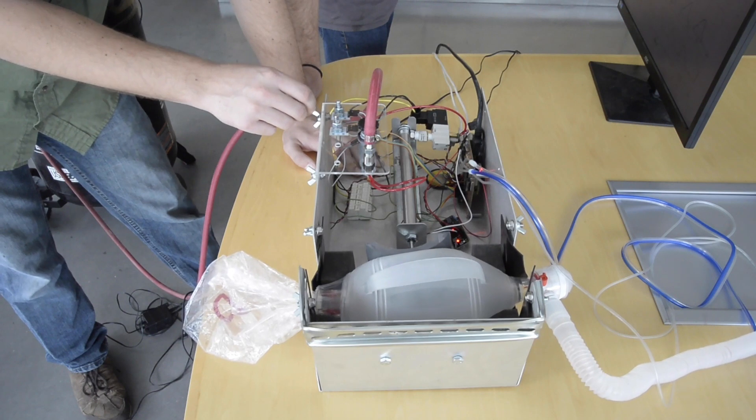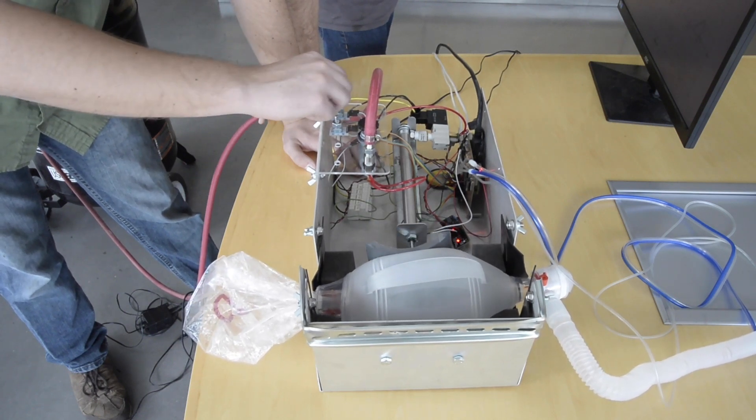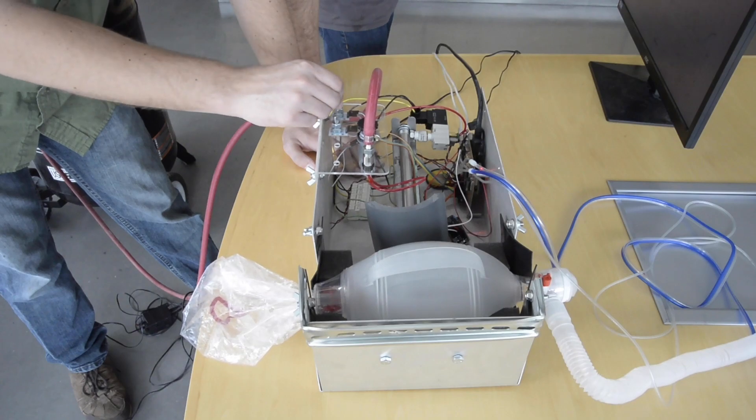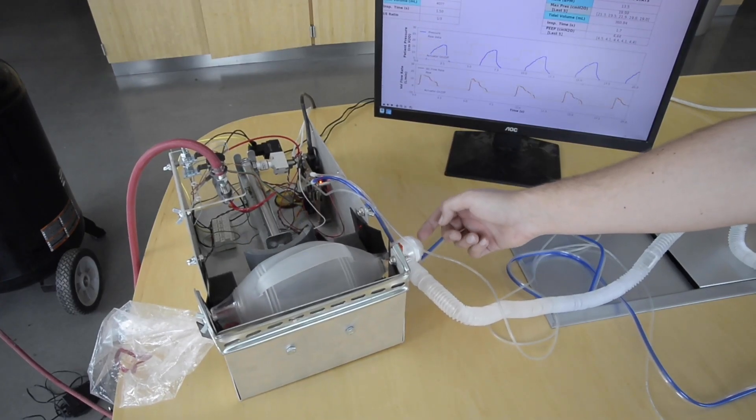Respiratory settings such as inspiration time and respiratory rate can be adjusted using the encoder knobs. The ambu bag comes with a safety pressure relief valve to protect the patient.